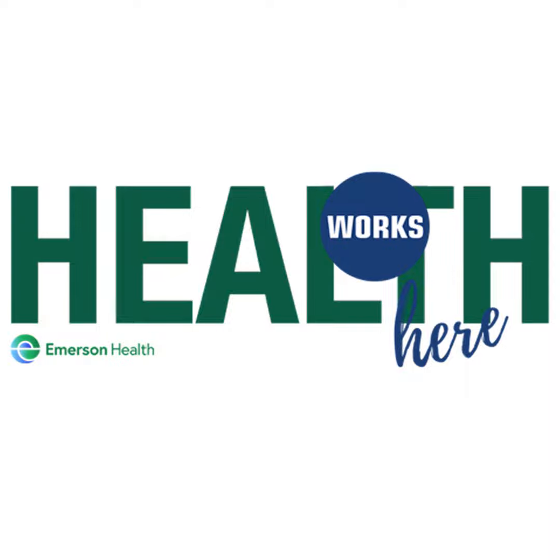So first, as we get rolling here, what is robotic-assisted surgery, and why is this particular robot called Mako? Robotic-assisted surgery is, for my purposes, a joint replacement surgery of the hip and knee that's assisted by a robotic device. The robot isn't like robots from cartoons. It doesn't really resemble a person, which a lot of my patients think it might, and it's not performing the surgery by itself. It's pretty much a really fancy tool that we use to perform the surgery, and it helps keep us on track with our plan from before the surgery and putting the implants exactly where we want to put them. And the reason they call it Mako is because it looks, I guess, in some ways like a Mako shark. It's gray and sleek looking.